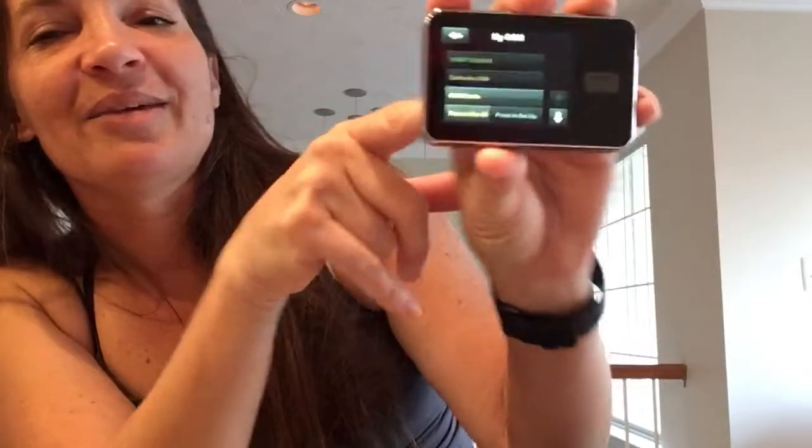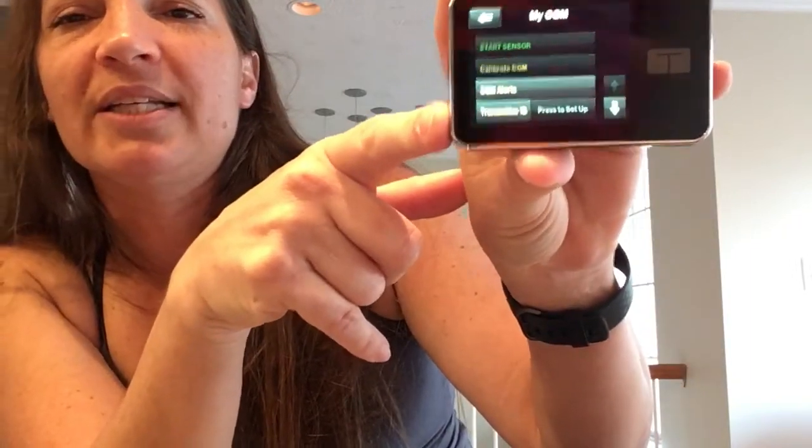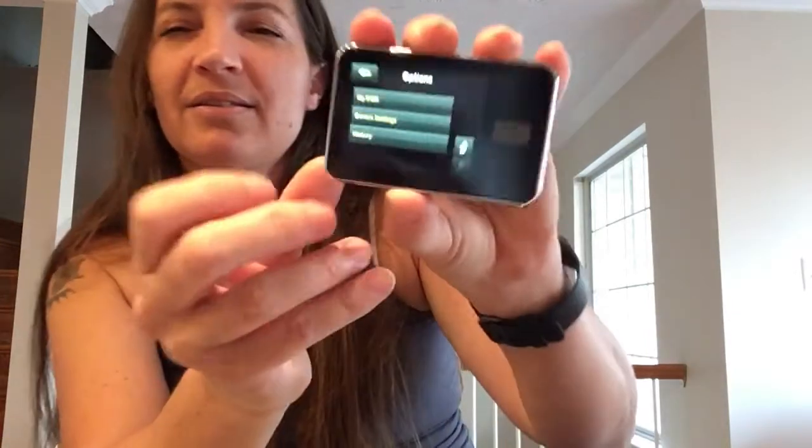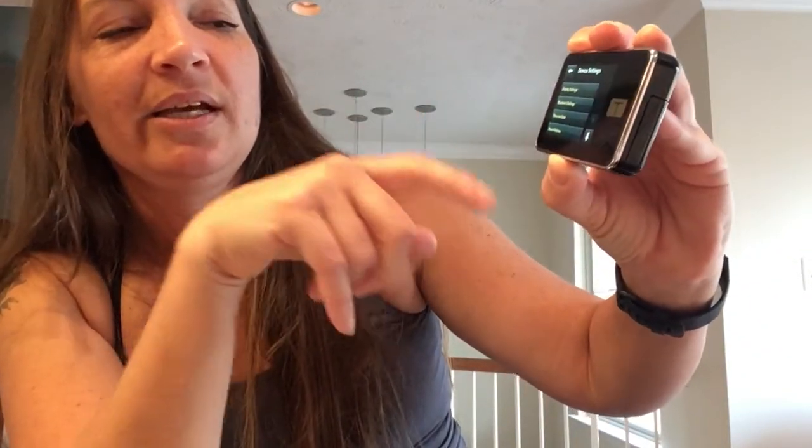Under my CGM is where you would do your CGM alerts, but this is also where you would enter a transmitter ID. We're going to come back to CGM alerts and then go down to the next option under my menu, which is device settings. I don't think you guys can see any of this — I'm so sorry. My CGM, then device settings was next for me. This is what you can find under device settings. First of all, there are display settings.